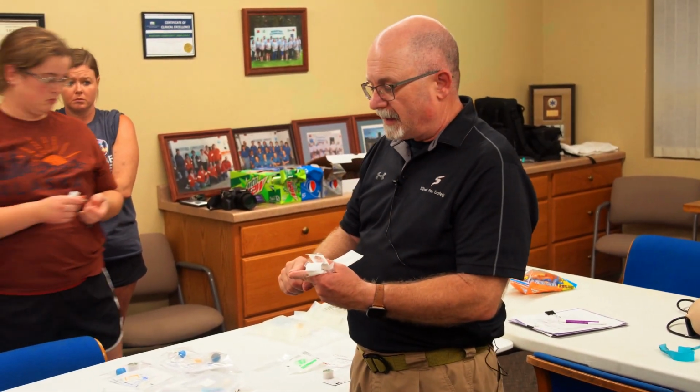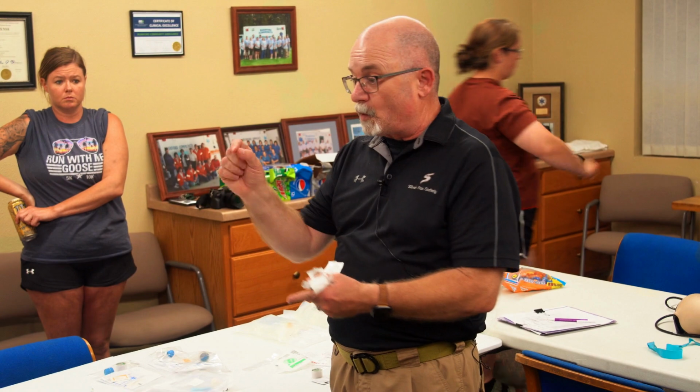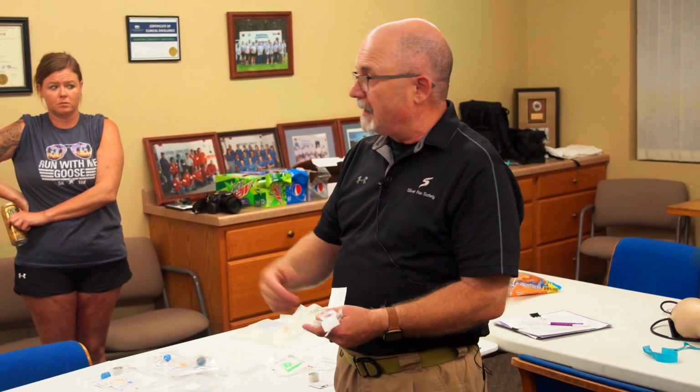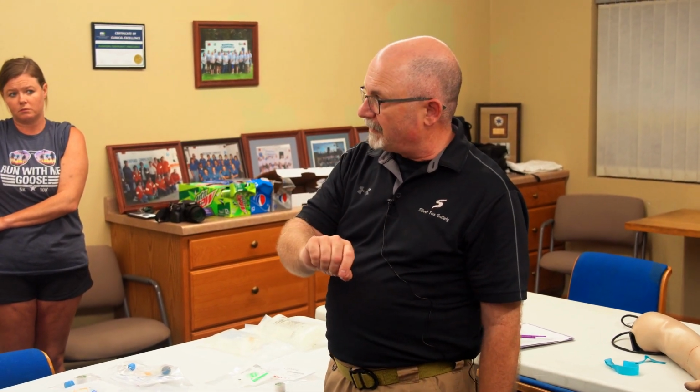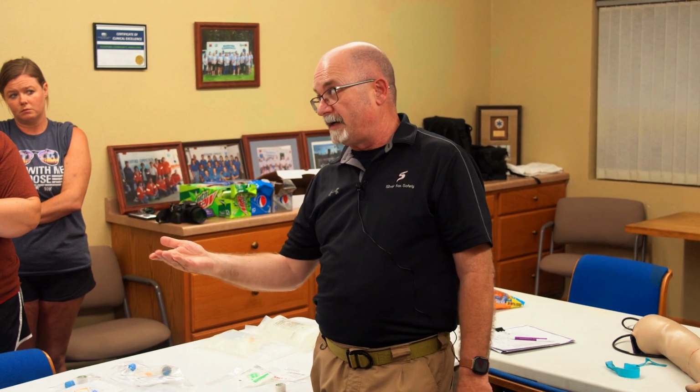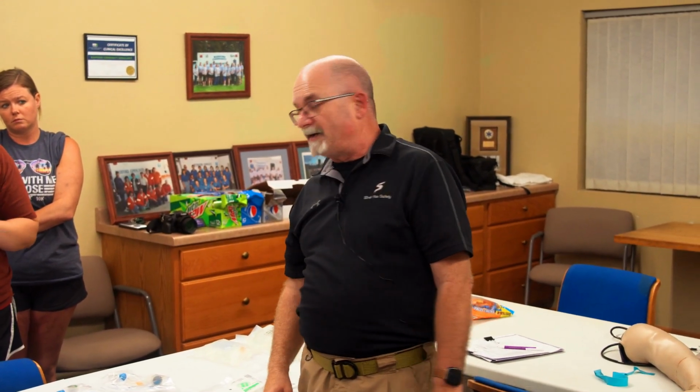So the attempt is either successful or unsuccessful. If it's successful, document where, what size catheter, and then any medication or solution that you used. And then your reassessments, your vital signs. So if you initiated it at 2015, you probably want to have another set of vitals at about 2020, and then depending on how critical they are, probably at least a second set of documented lung sounds within that 15 minutes, or at least clarify in the narrative that lung sounds remained clear throughout the remainder of transport. You're looking at lung sounds because there are those implications.